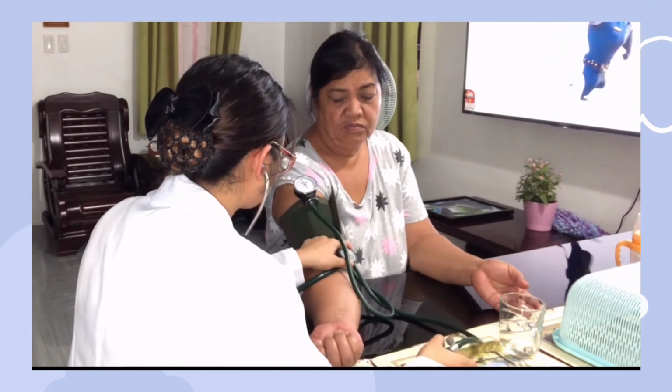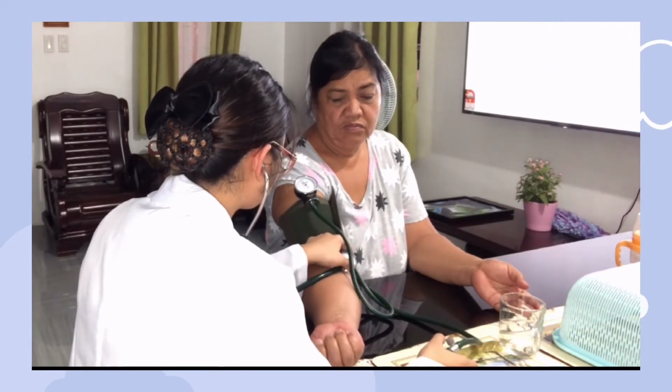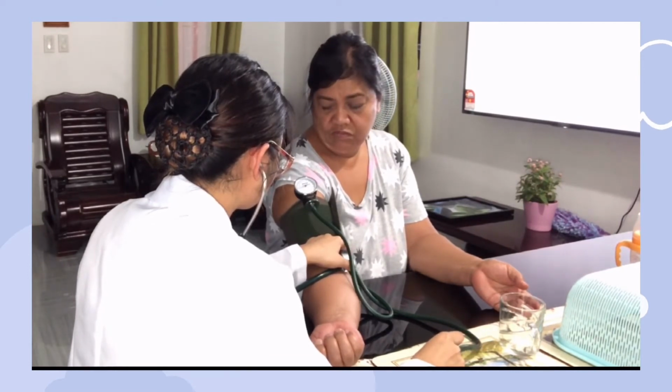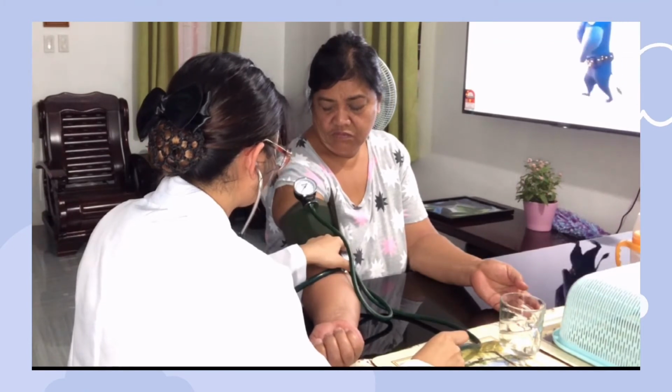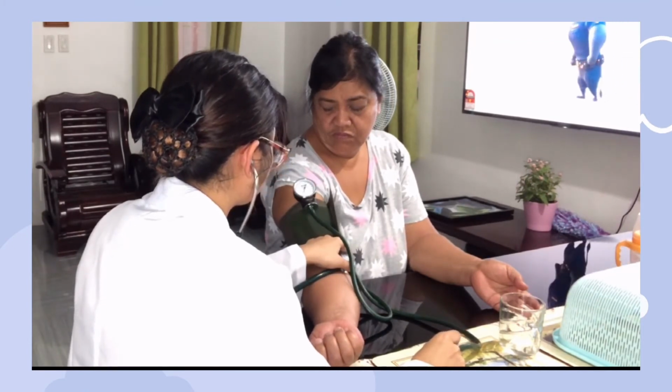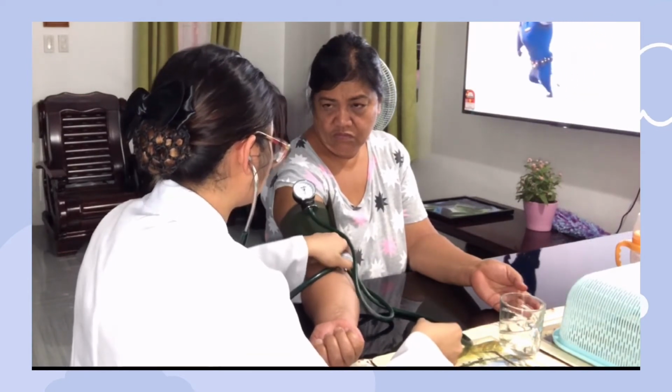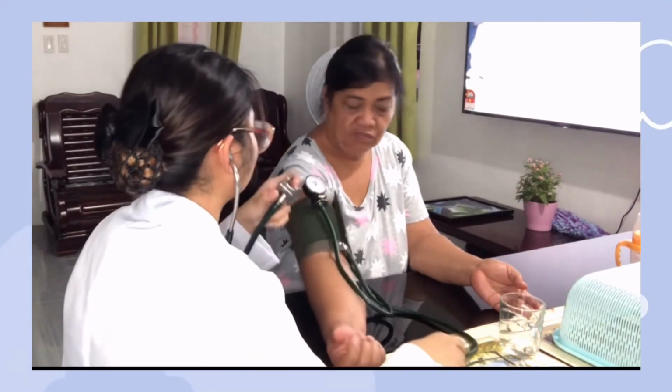Pump up the cuff until the sphygmomanometer reads 30 mm of mercury above the point where the brachial pulse disappeared. Release the valve on the cuff carefully so that the pressure decreases at the rate of 2 to 3 mm of mercury per second. As the pressure falls, identify the manometer reading. Deflate the cuff rapidly and completely.